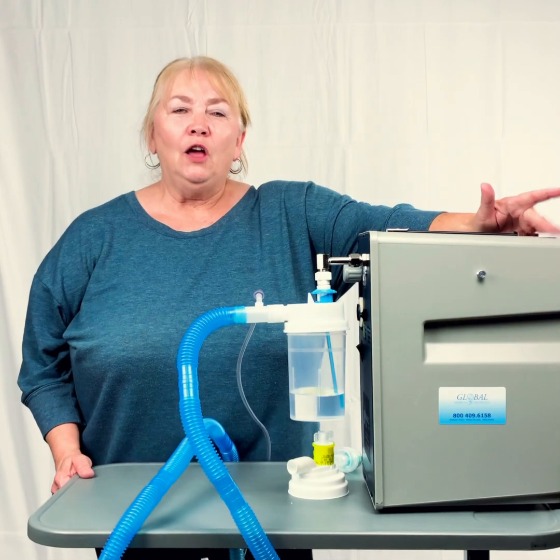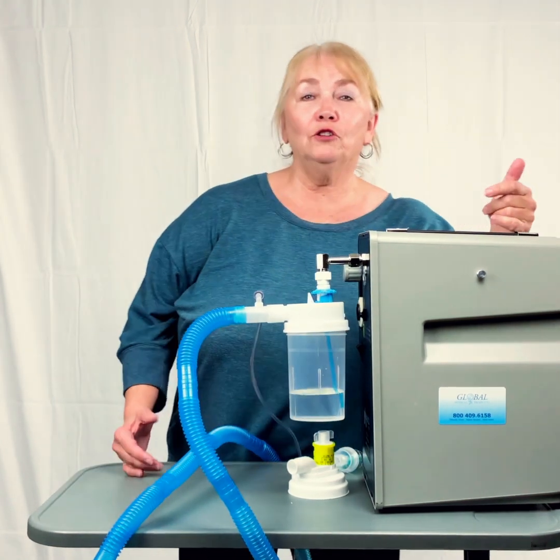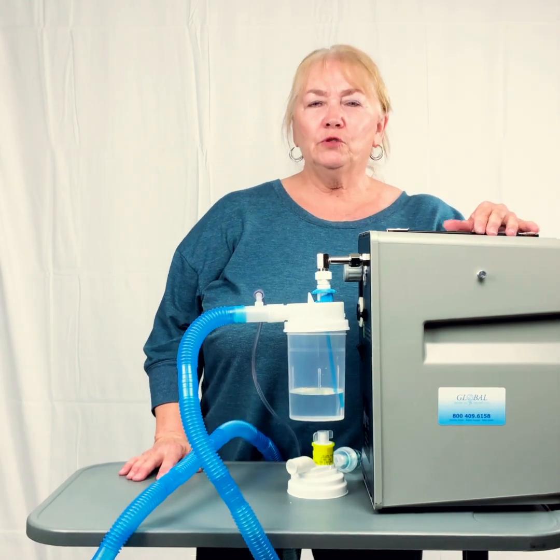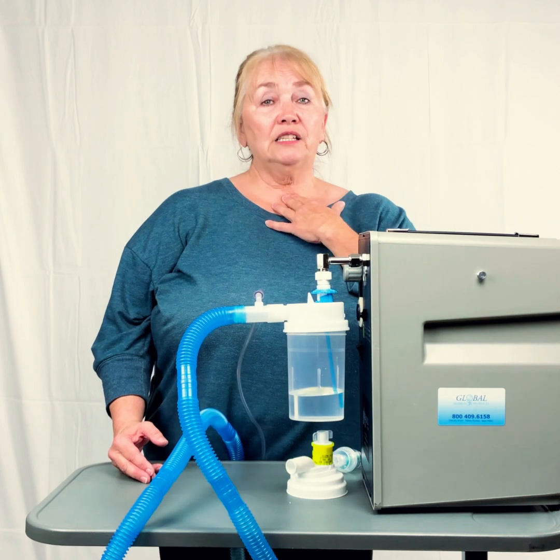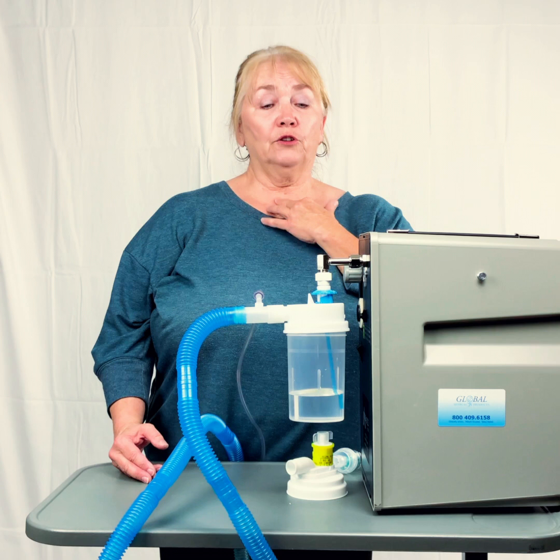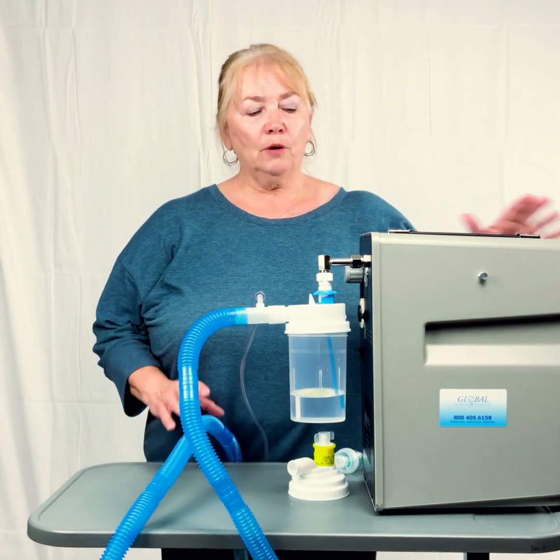Hello again. Now we are on trach compressors, high flow compressors, 50 psi, whatever verbiage is used. It's the same thing. This is for a patient that has a trach, and a trach is a tube that goes into their throat. Or if they just have a stoma, the hole that's in their throat, and they need to add some moisture. So we're going to do troubleshooting with this.